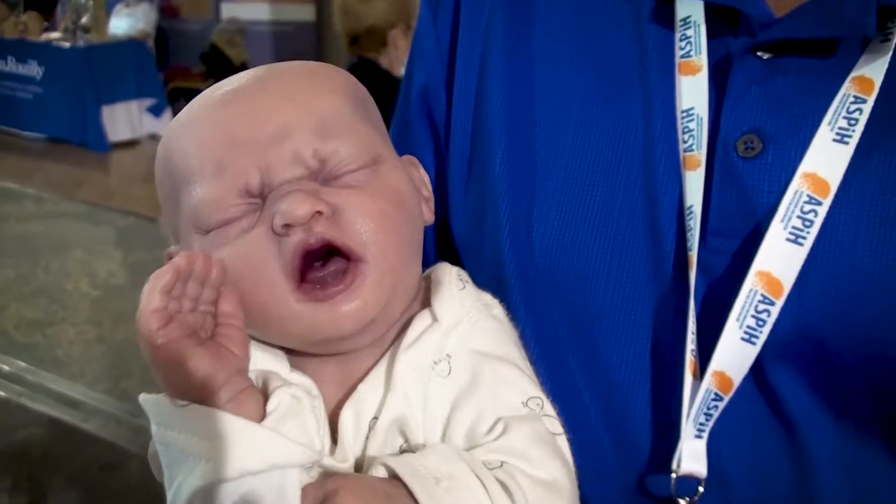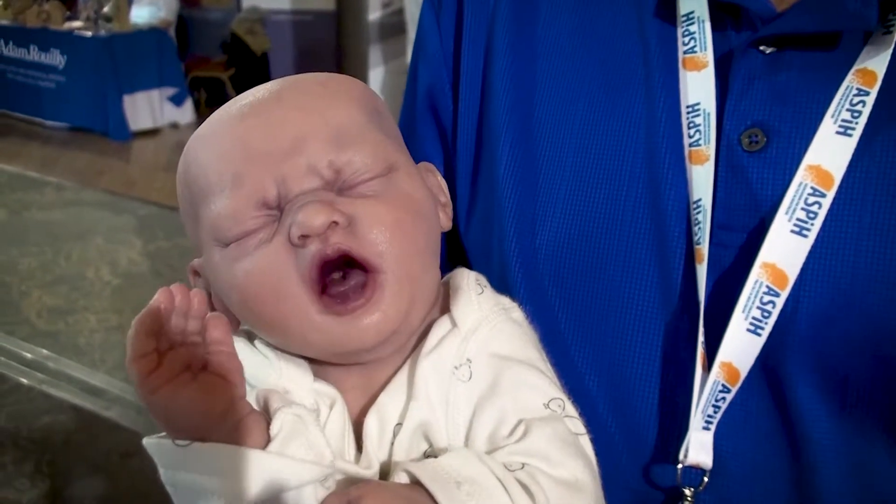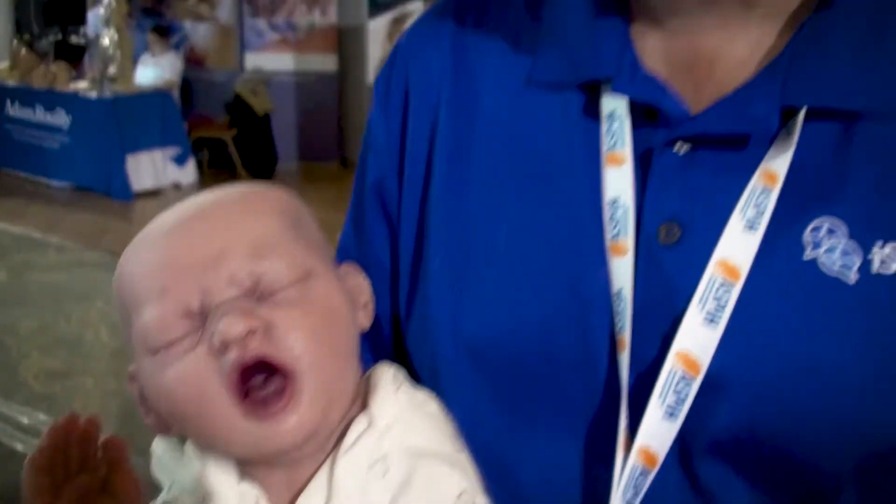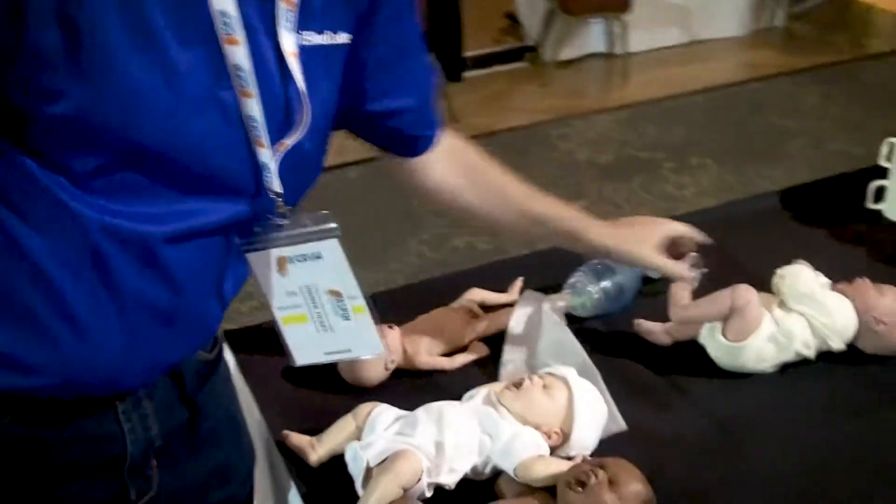The next one I want to talk to you about is this particular mannequin. You can see just enough movement in it to question whether this is high or low fidelity. This is actually a tongue-tied breastfeeding mannequin. It's designed for antenatal education, but we love it because it creates emotion — we often hand it to people and watch how they hold this particular baby.